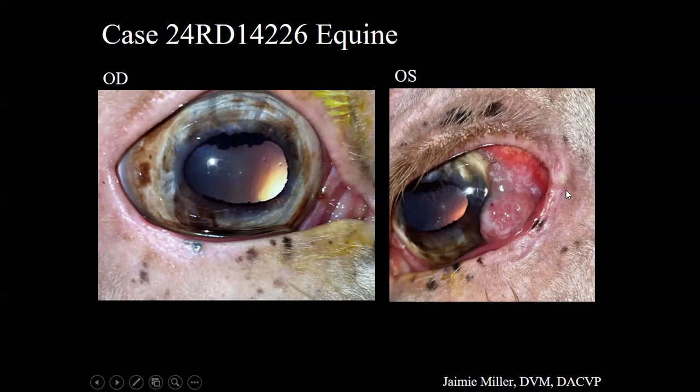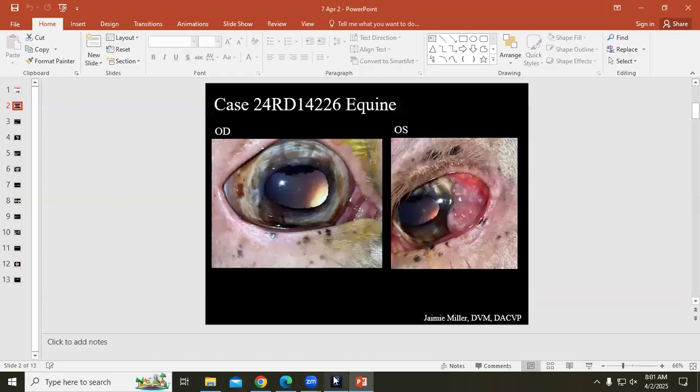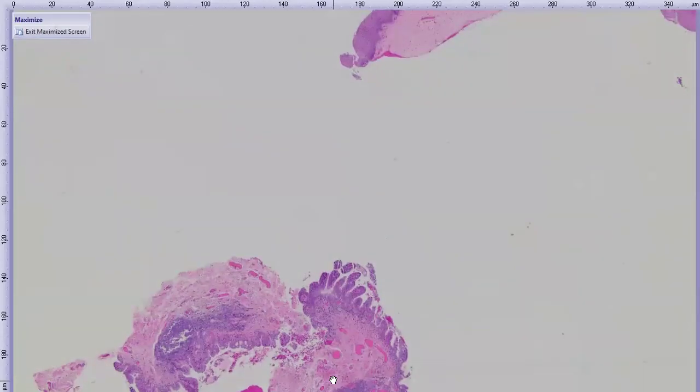And then I also have some tissues. I said the right lower eyelid was pigmented. It's a little bit blurry and shiny, and I believe this is maybe the lesion that they were trying to sample to give us. So we are going to take a look at some of these masses from this horse. So, starting with that large conjunctival corneal mass on the left eye.